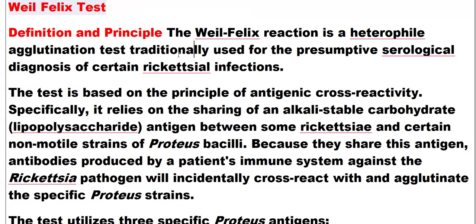Specifically, it relies on the sharing of an alkali-stable carbohydrate lipopolysaccharide antigen between some Rickettsia and certain non-motile strains of Proteus bacilli. Because they share this antigen, antibodies produced by a patient's immune system against the Rickettsia pathogen will incidentally cross-react with and agglutinate the specific Proteus strains.